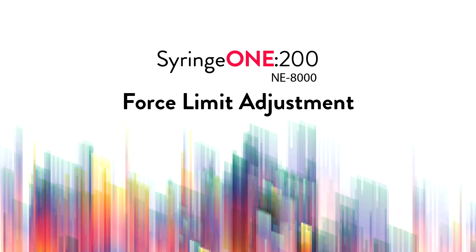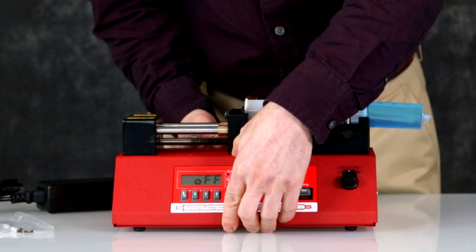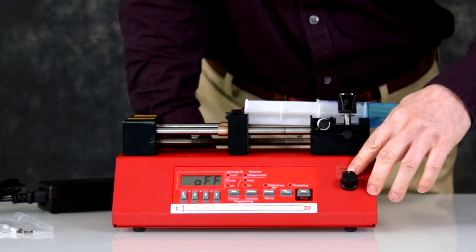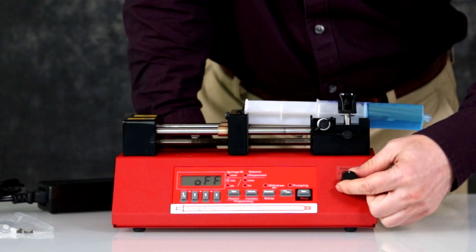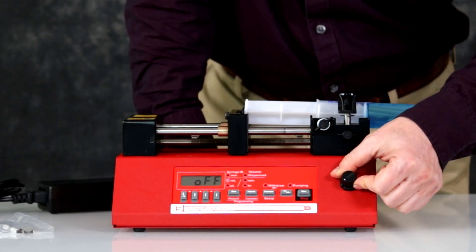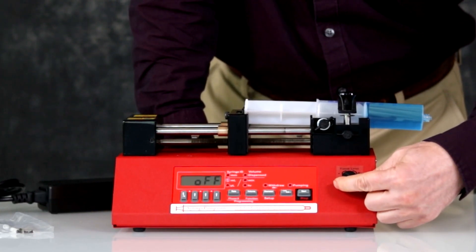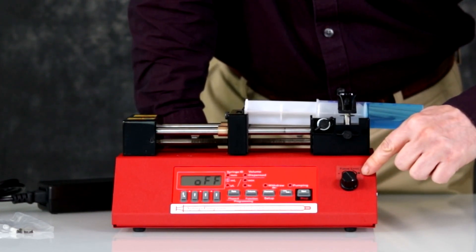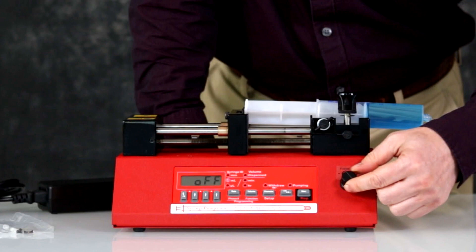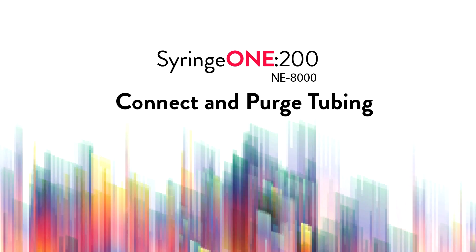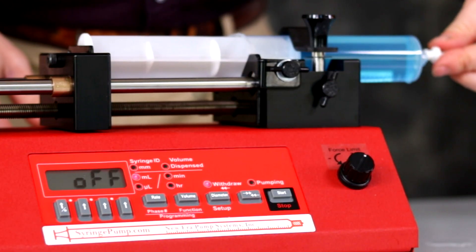NE-8000 force limit adjustment. At the front is a force limit adjustment. Turn the knob to change the force. Turn towards plus for higher force. To limit force, turn towards minus. NE-8000 connect and purge tubing. Connect your tubing to the syringe.